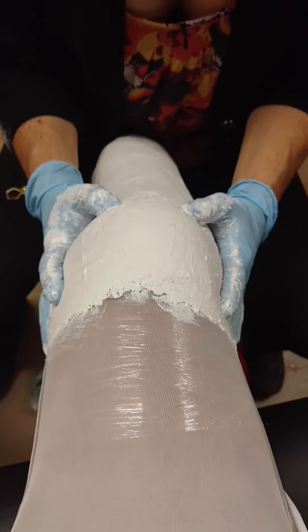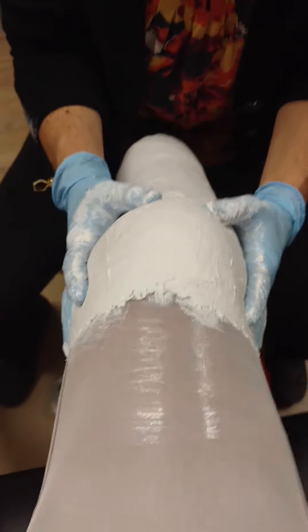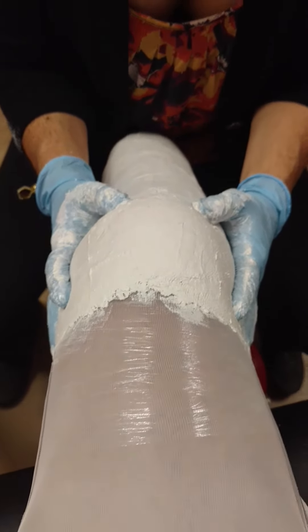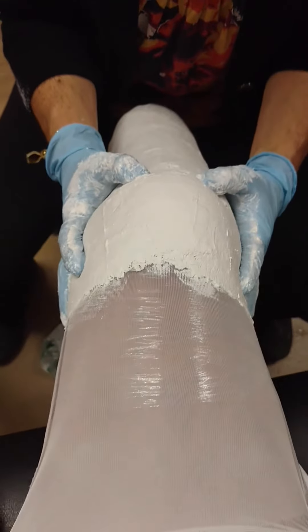His socket fits pretty bad right now because he's shrunk so much. He hasn't even had it that long — October 19th. He just shrank a bunch. He's super active.